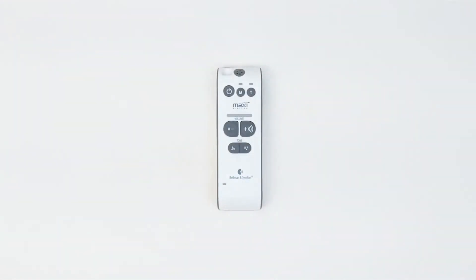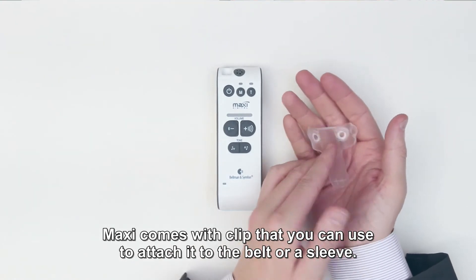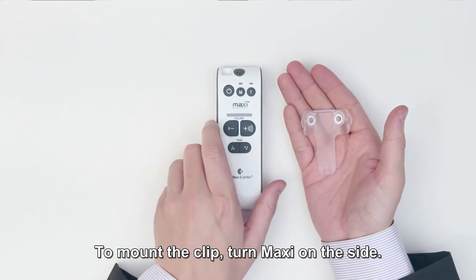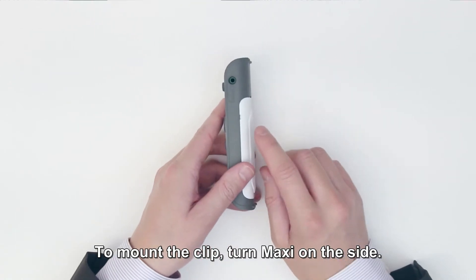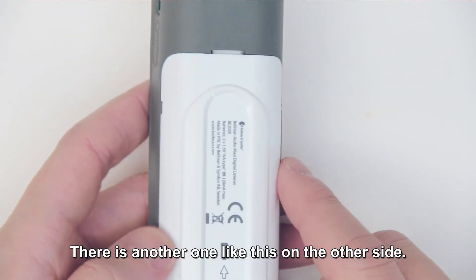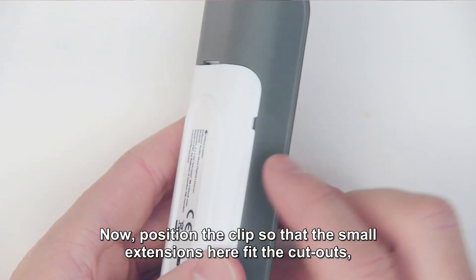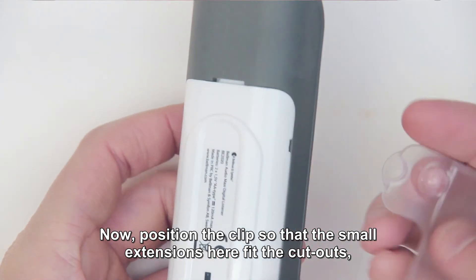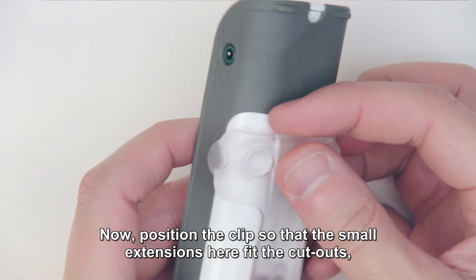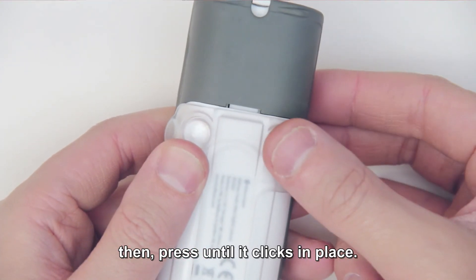Attach the clip. Maxi comes with a clip that you can use to attach it to the belt or a sleeve. To mount the clip, turn Maxi on its side. Here you will find a small cut-out, and there is another one like this on the other side. Now position the clip so that the small extensions fit in the cut-outs, then press until it clicks into place.